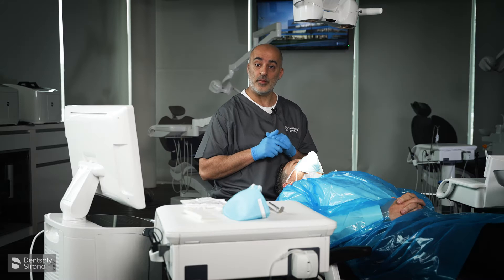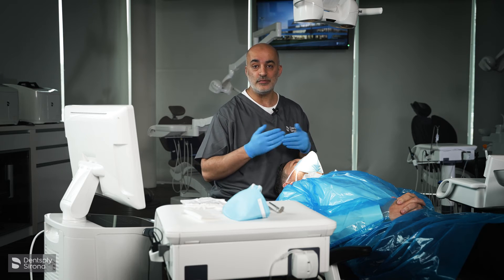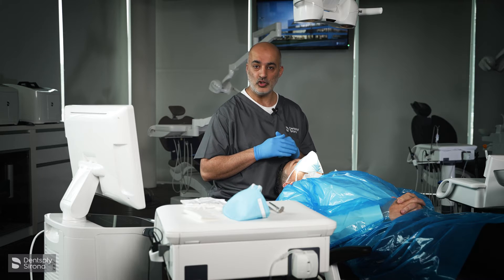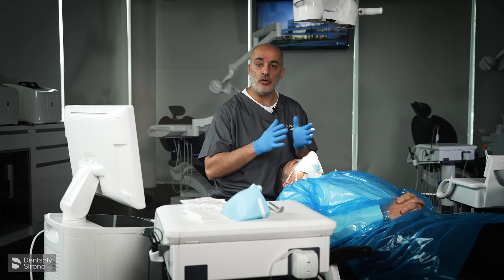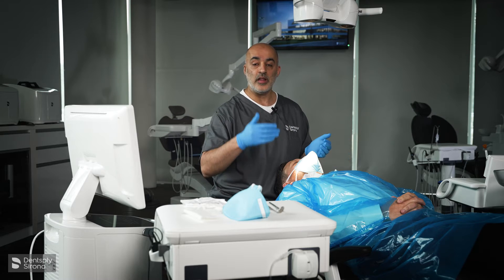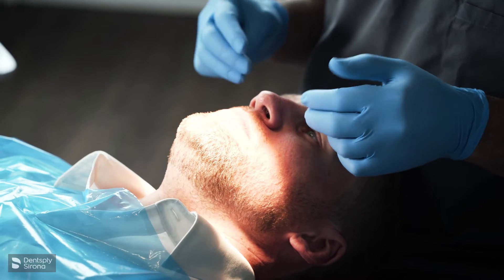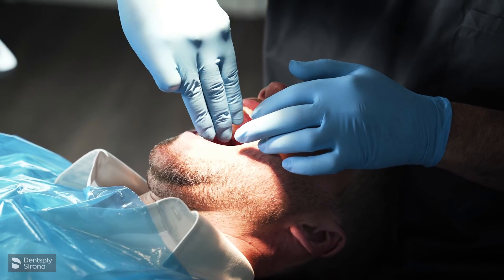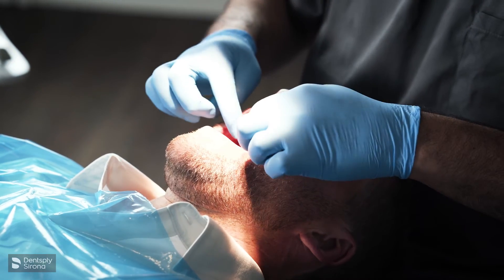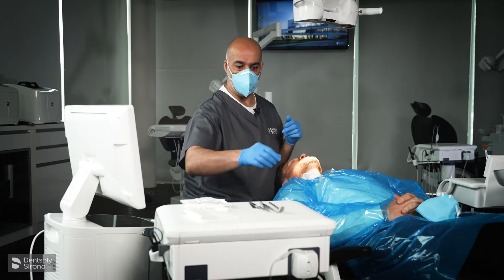We're going to assess the patient intra-orally and we're looking for some signs. The main sign is mouth opening — how restricted is mouth opening, because that obviously makes scanning a little bit more challenging. We're going to ask the patient to open as wide as they can. I can get three fingers in, so I know I've got about 55 millimetres of mouth opening, which is going to make scanning a little bit easier.